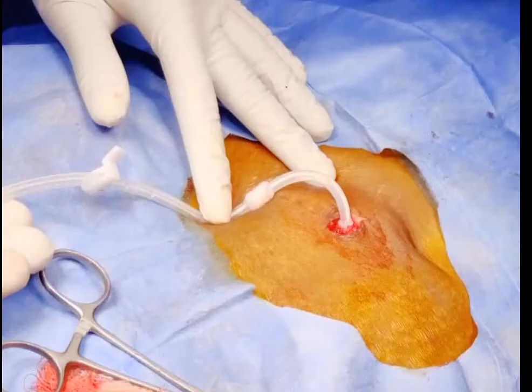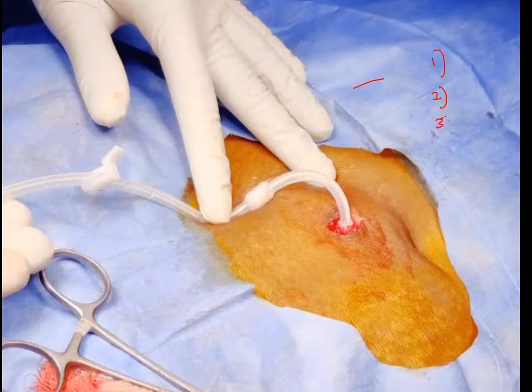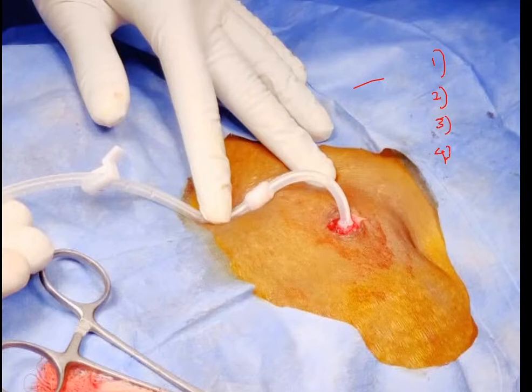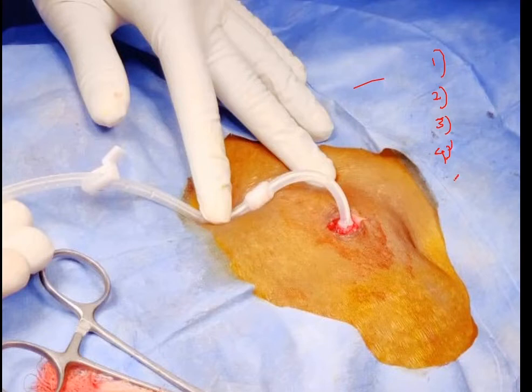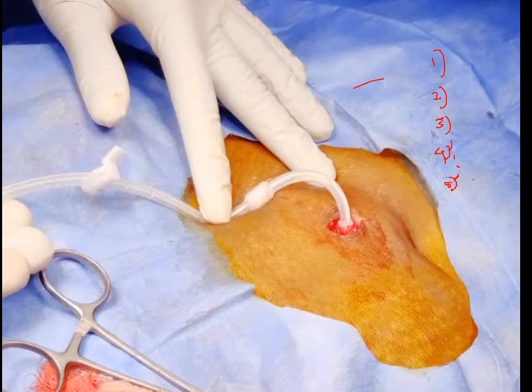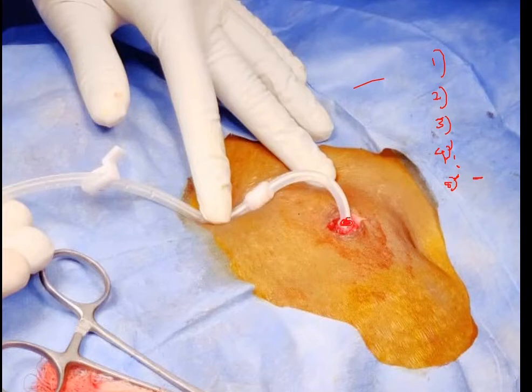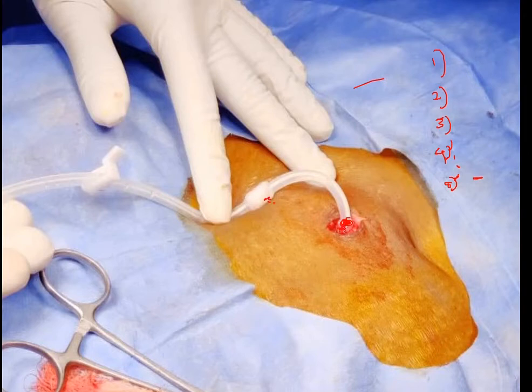To recap the steps completed: incision and dissection to reach the rectus sheath, insertion of the gray cannula, guide wire insertion, insertion of the peel-off dilator sheath, removal of the guide wire and dilator while keeping the peel-off sheath in place, and then insertion of the catheter. Now the first cuff is positioned at the rectus sheath level and the second cuff is still outside — we must push to ensure the first cuff goes in between the rectus sheath.